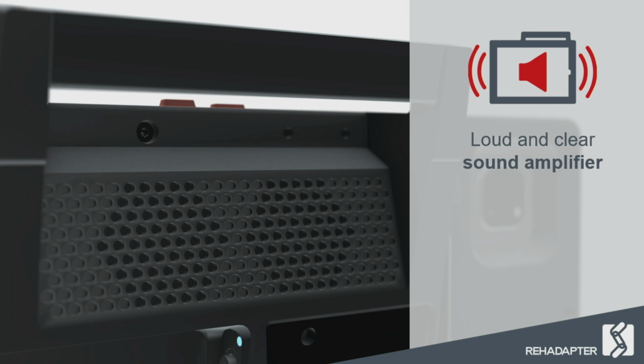The high quality sound of the device is achieved with one large integrated speaker inside the Rehadapter, on the back side of the device, and it is also classroom ready to be understood. On top you have rubberized volume buttons that are always accessible.